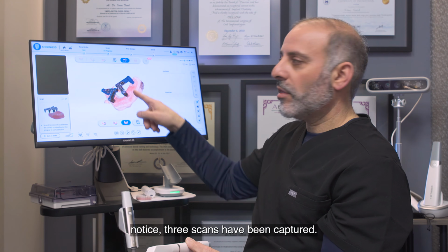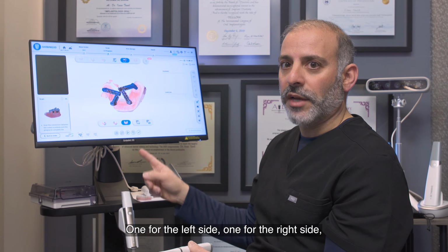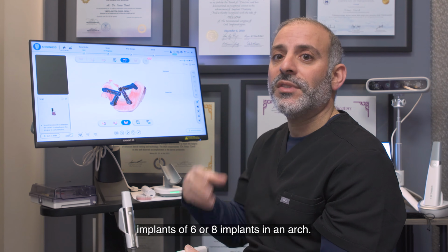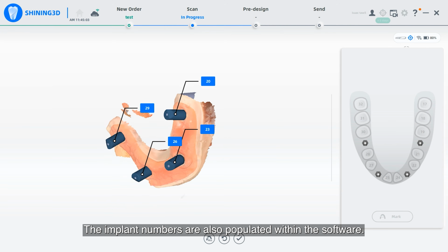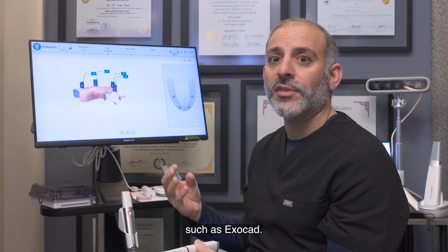Now, as you can notice, 3 scans have been captured. One for the left side, one for the right side, and one for the anterior. This is especially important when taking on multiple implants of 6 or 8 implants in an arch. The implant numbers are also populated within the software, making this for easy importation into third-party software such as Exocad.